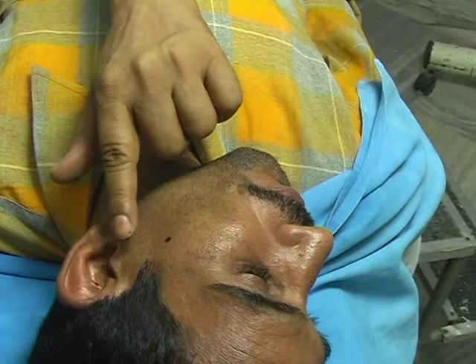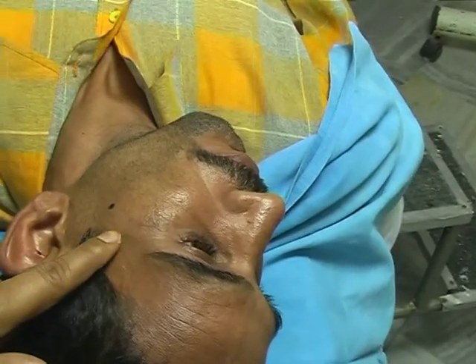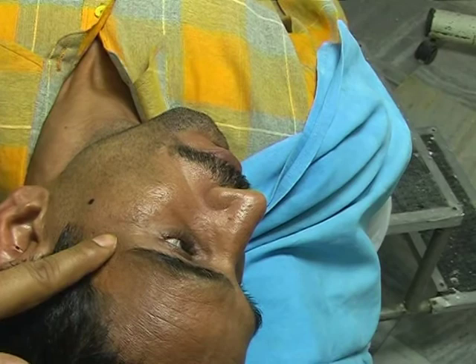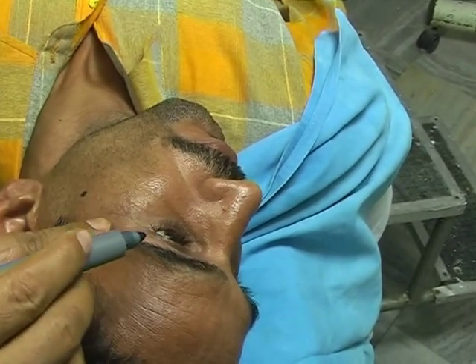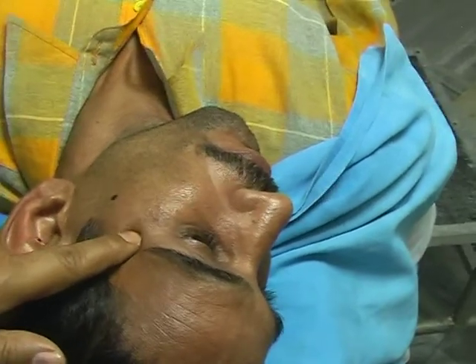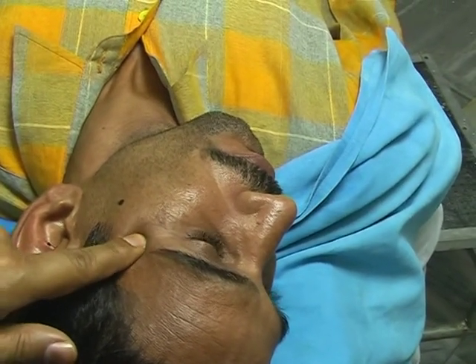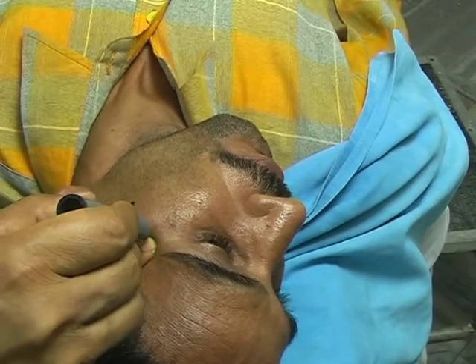The entry point of the needle is in the innermost part of the mandibular notch. The second anatomical point is you go above the zygomatic arch. This is the prominent point of the zygomatic arch and this is the lateral margin of the orbit. So here, in this angle, I am putting my index finger just at the apex of this angle and put another mark.